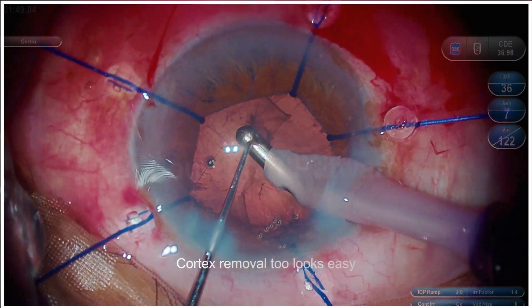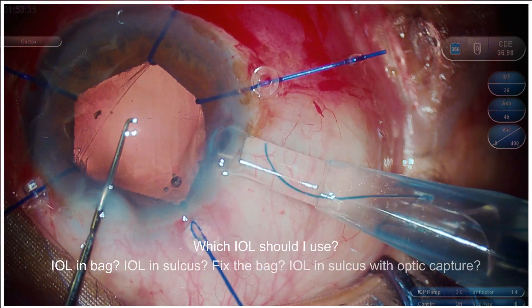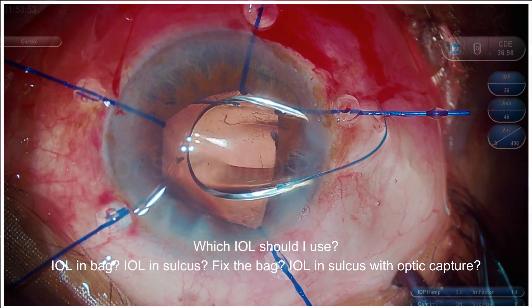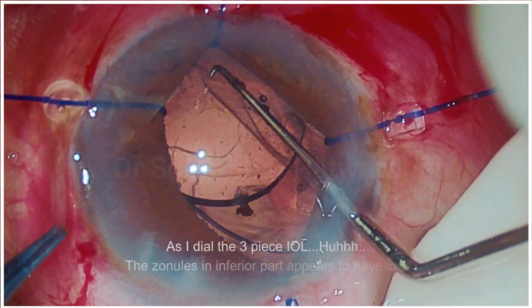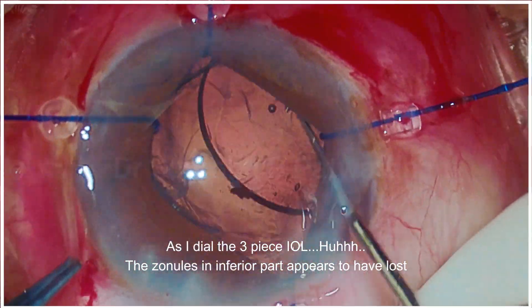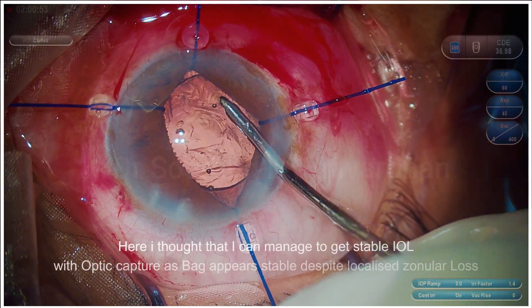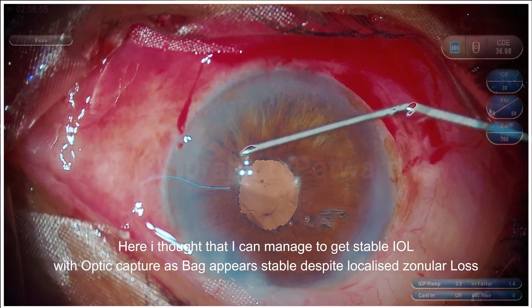The bag looks stable with the support of these iris hooks. Of course, still there is a dilemma. After cortex removal, I want to implant the IOL. Should I put the IOL in the bag, or should it be in the sulcus? Should I fix the bag? IOL in the sulcus with optic capture? I thought I will do that — put the IOL in the sulcus and do optic capture like the IOL trap technique. But as I dial the three-piece IOL, I find that the zonules in the inferior part appear to have been lost during the procedure. Still, I think the rest of the sulcus is enough, so I put the IOL in the sulcus and do optic capture.